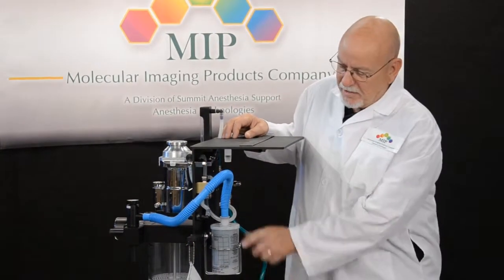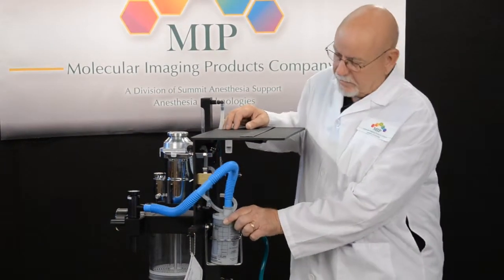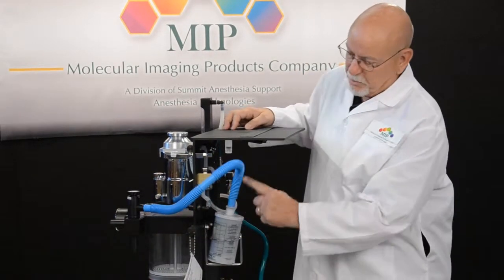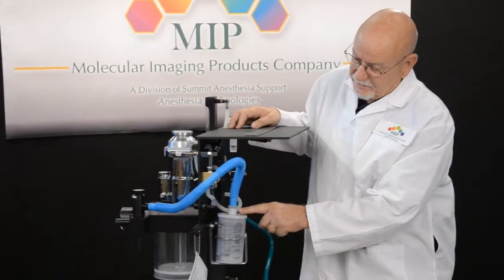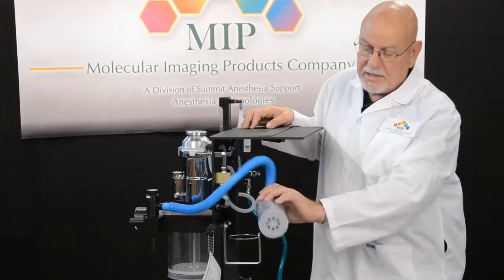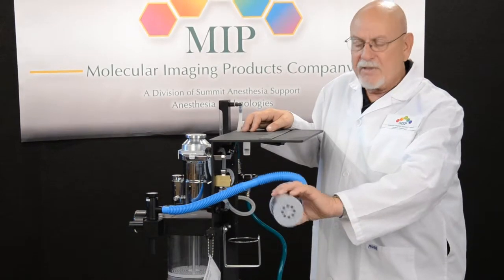This is the proper position of the activated charcoal filter, with the conduit attached to the pressure relief valve on the re-breathing head or non-re-breathing system. Going into the activated charcoal filter in the upright position, you can see the holes at the bottom of this.